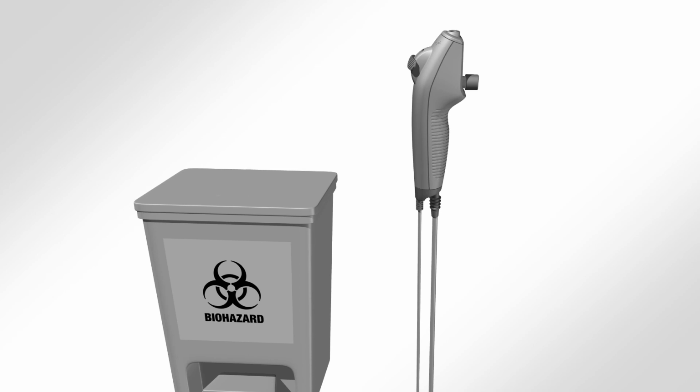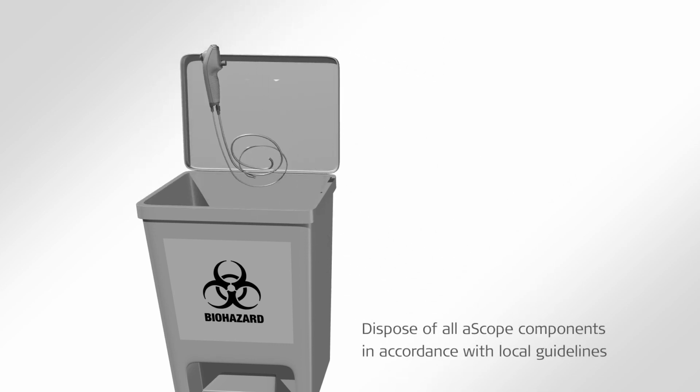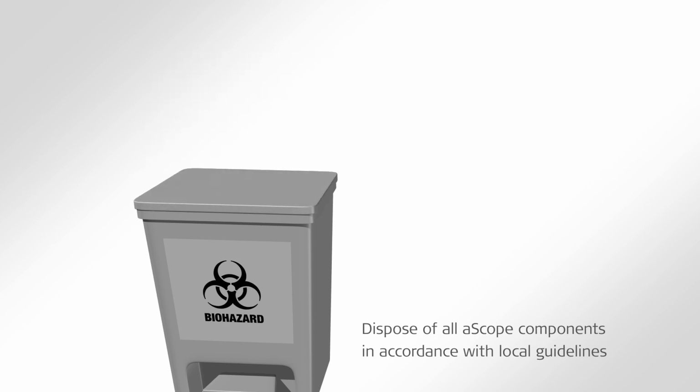The aScope is a single-use device and must be disposed of in accordance with local guidelines for collection of infected medical devices with electronic components. Do not soak, rinse, or sterilize this device, as these procedures may leave harmful residues or cause malfunction of the device. The design and material used are not compatible with conventional cleaning and sterilization procedures.